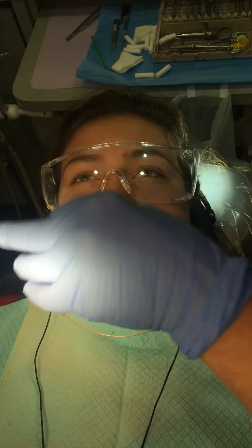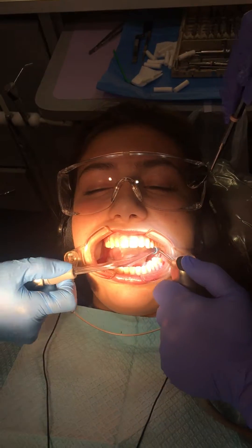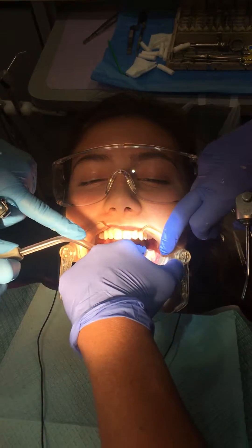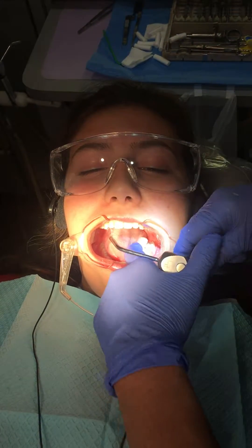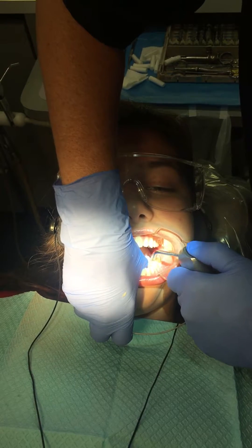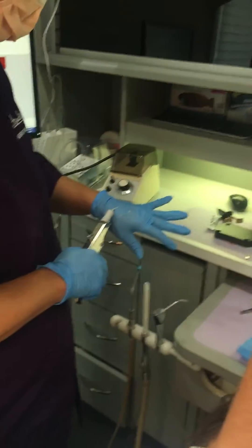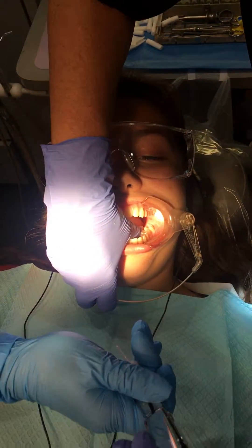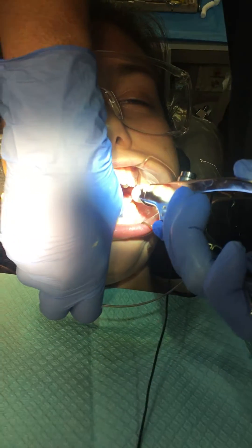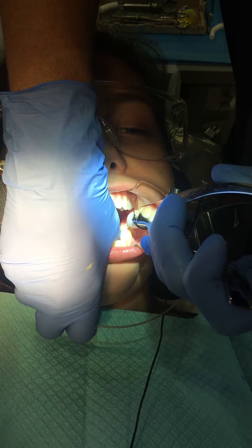Just relax your tongue there, Tori. The tooth has to be super clean and super dry. So we're just filling in the deep crevices and grooves in these molars. This is a preventative technique to try to decrease the potential for decay in the future.